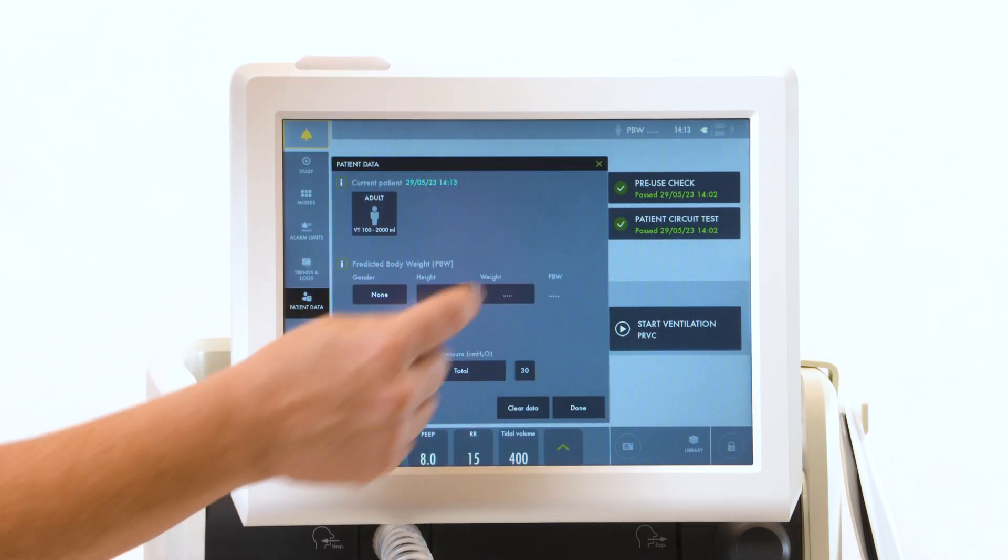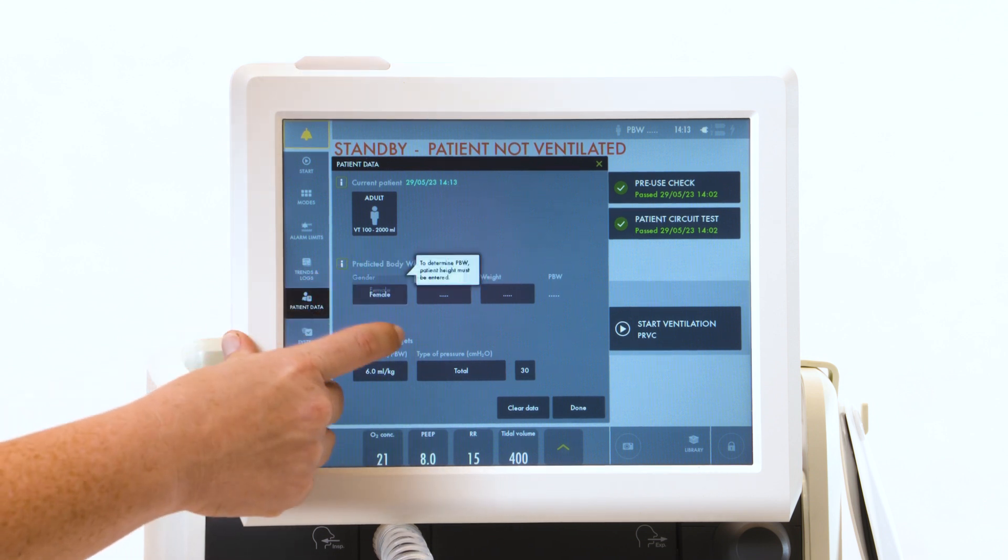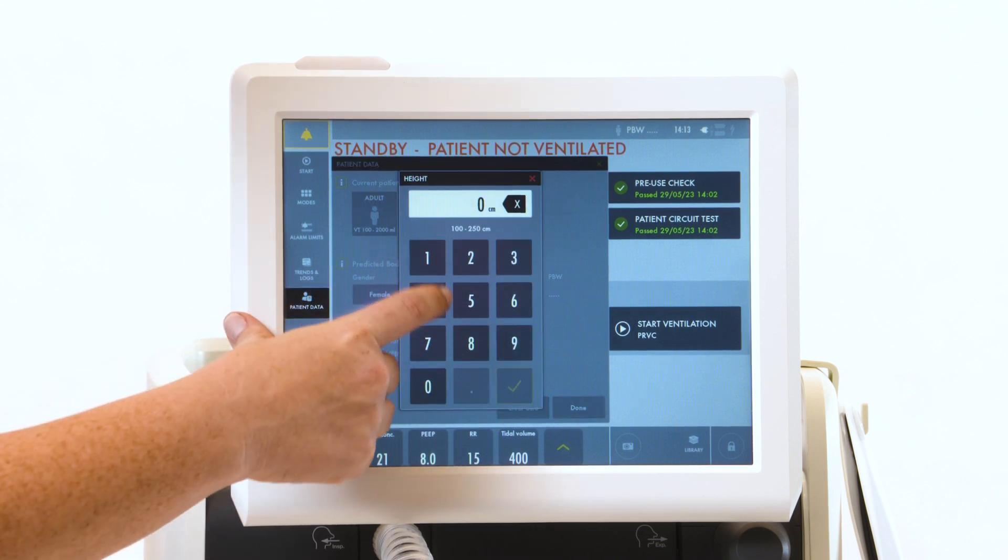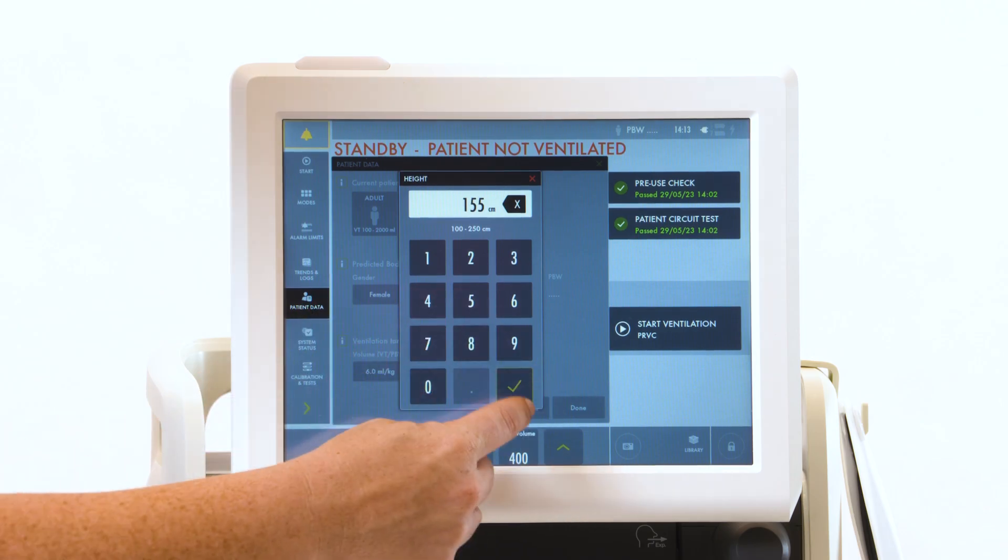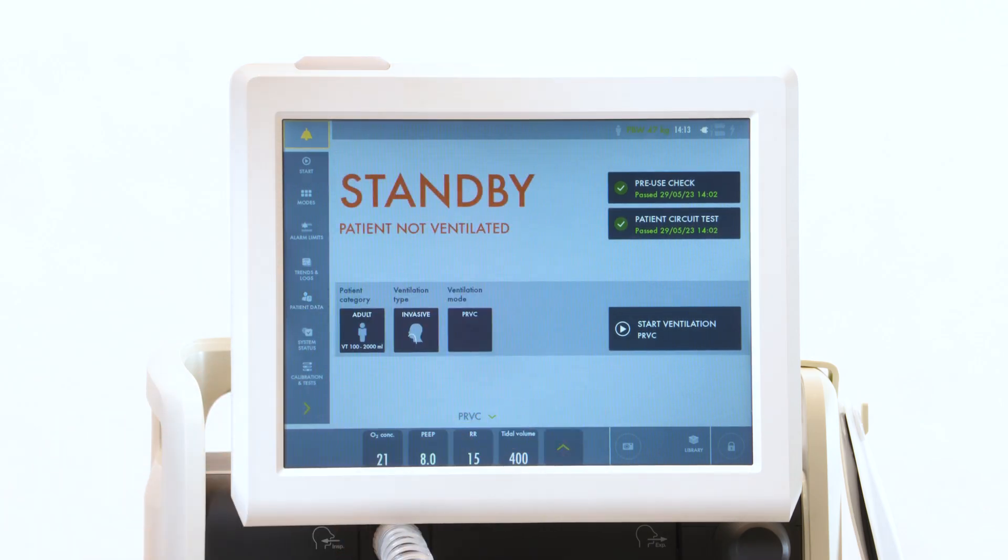Select patient data. Put in their gender and their height in order to do predicted body weight.